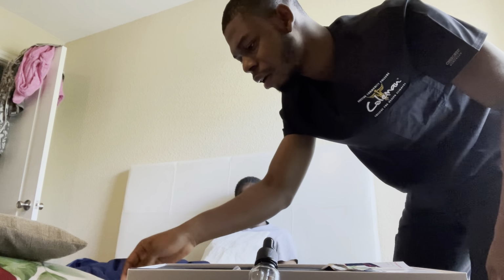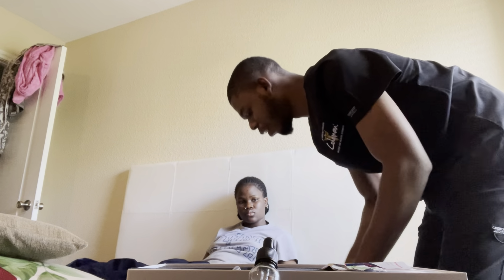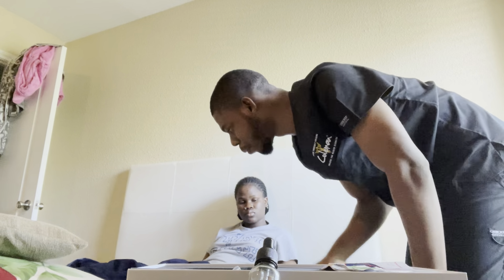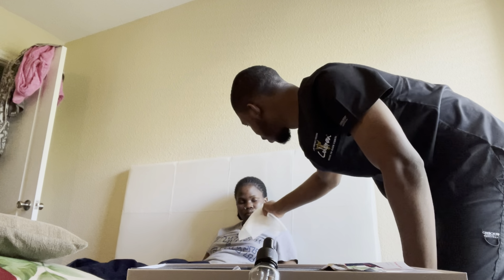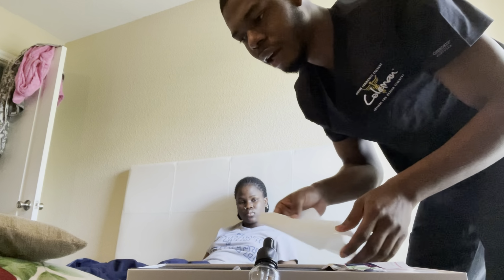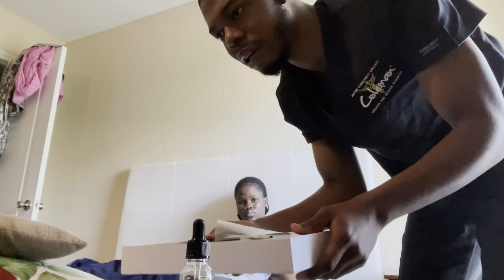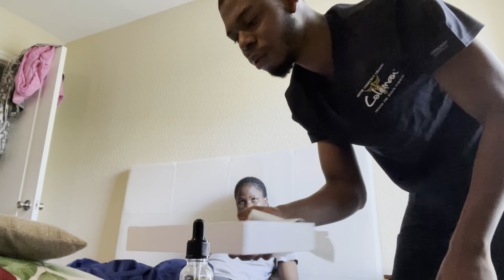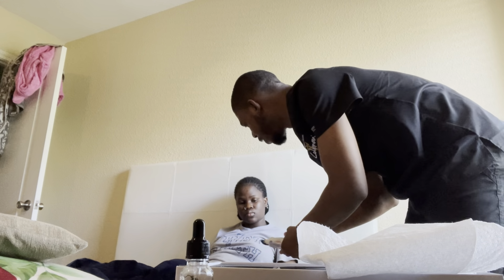After I'm done, I will take the drape off the patient's chest, and I will trash that too. I will get a new drape and give it to the patient in order to clean her face. I will put back the oxygen mask. When I'm done, I will dispose of the suctioning kit in the receptacle, and after that, I will perform oral hygiene for the patient.